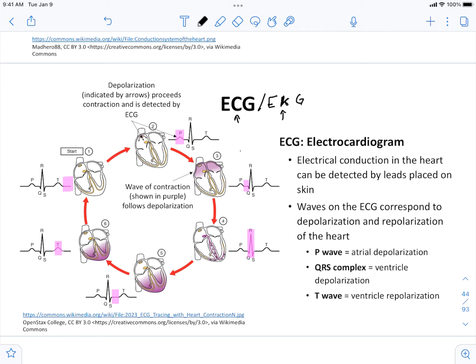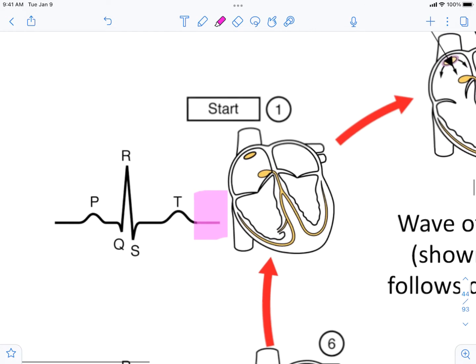So let's look at the ECG. Let me first help you identify the different components. If we zoom in here, let's just pick the first one. This is where we're going to start anyway. This P wave, so if we look at this, let me switch colors. We'll follow this along in blue. This flat line here is what we call an isoelectric line. And it means that there's, in essence, no net change to the direction of the electrical current. If there is movement of electrical current, it's canceling each other out to give us this flat isoelectric line. That's an oversimplification, but for our purposes it suffices.